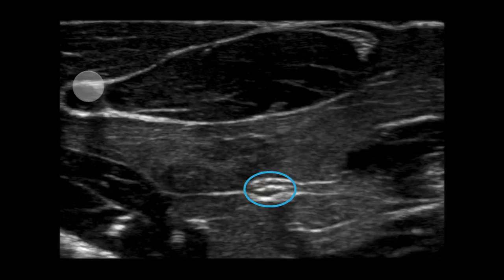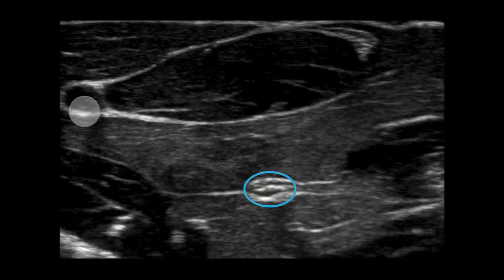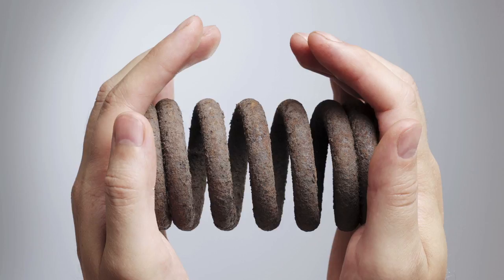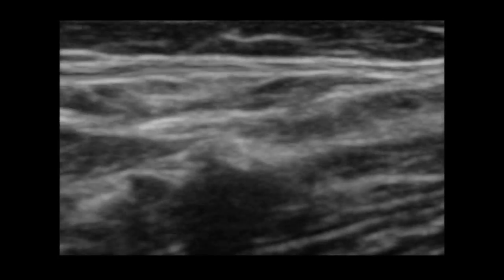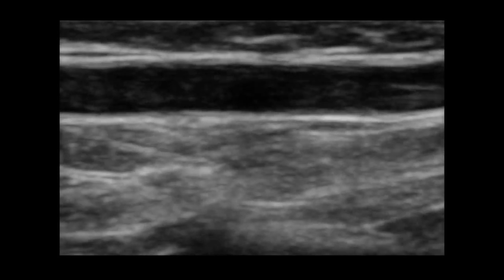Lastly, draw your attention to the top left of your screen at this circular anechoic object. Without putting pressure on the probe, I can't tell whether this is vein or artery; however, I know it is one or the other. To distinguish vascular structures, we need to use compression. Nerves cannot be compressed without significant force. Vessels, on the other hand, can be. Watch as I push down on the skin and the vein compresses.